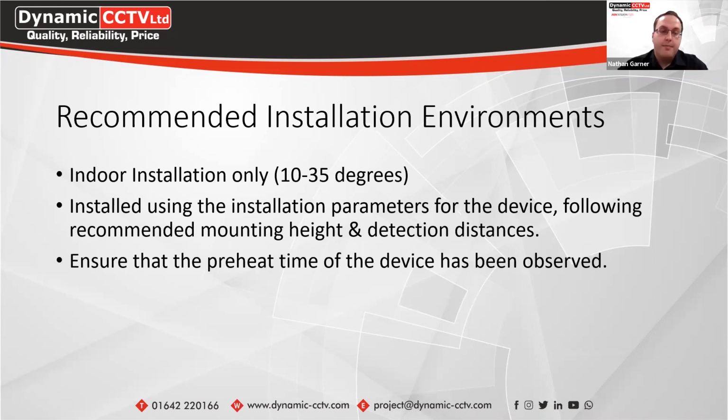It's also important to ensure that the preheat time of the device is being observed, and this can be different depending on the cameras that you're using. Handheld cameras have a faster preheat time, whereas the installation of the turrets and such have approximately 90 minutes of preheat time before you can get accurate results from the camera itself. And this would be when they're either first powered on or if they've been turned off for a prolonged period of time. You just have to wait 90 minutes after first powering on.